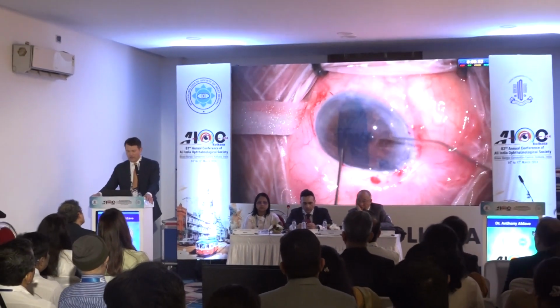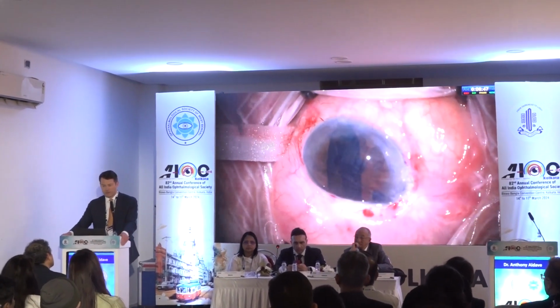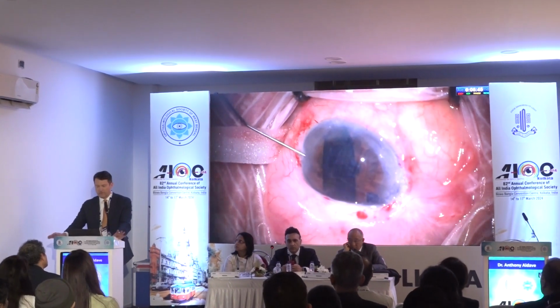But here I'm just struggling to try to get one portion of this graft to unfold to my left, which is my preferred technique, and then unfold to my right. Even when I'm just trying to move the graft over, it's not moving. So in a case like this, you have to avoid repetitive tapping that's non-purposeful. That's why I tell the fellows, every movement should have a purpose.